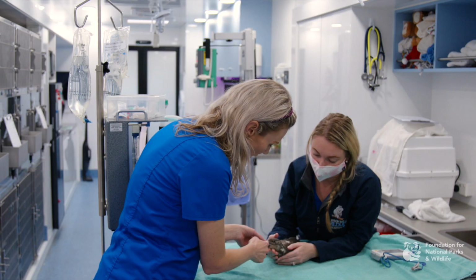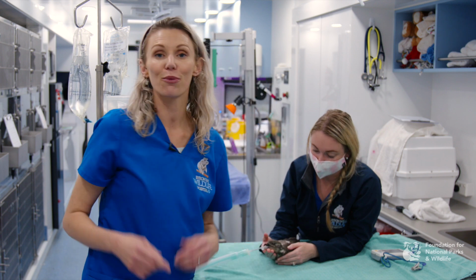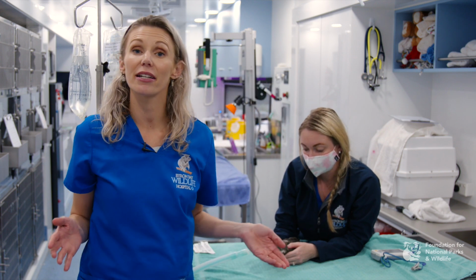Once you've placed the tube and you've taped it, then you can start the rest of your physical examination under anaesthetic. As with any other animal, use your normal monitoring equipment such as a pulse ox or just your stethoscope. A capnograph is also really important for these guys too.